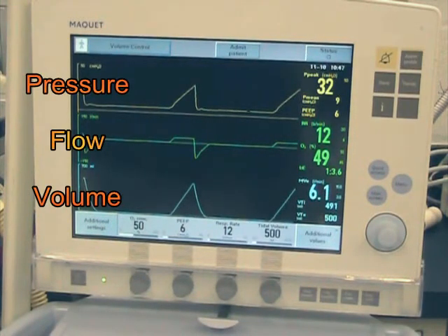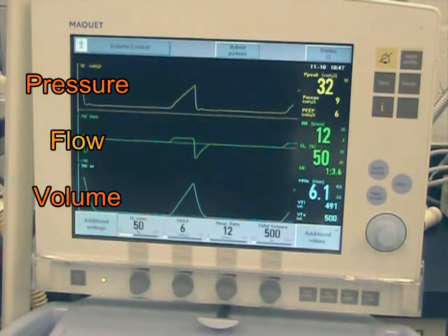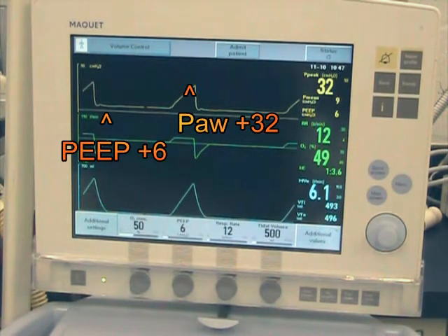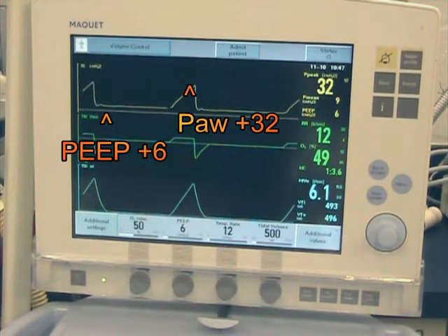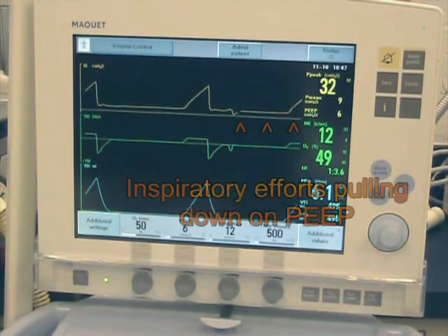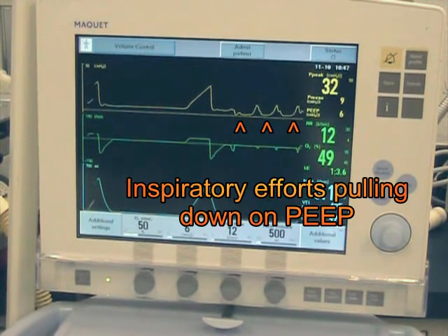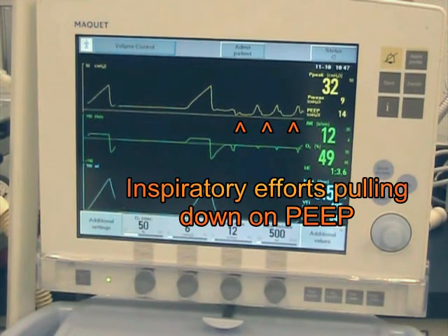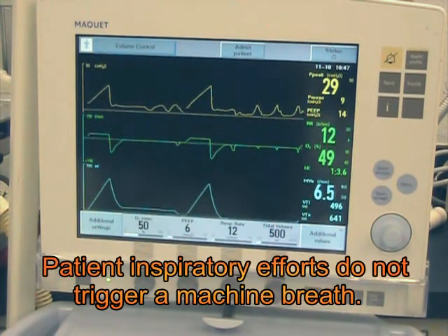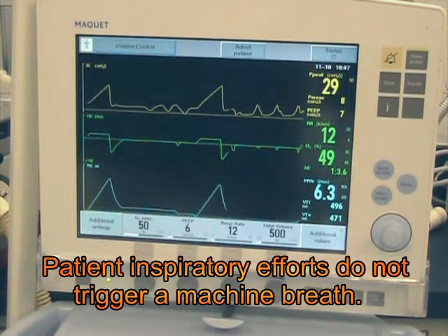Control ventilation is when the ventilator will not respond to any of the patient's inspiratory efforts. In this case, we'll see the patient attempt to pull — there are some breathing attempts, moving no air, triggering none of the inspiratory breaths from the ventilator.